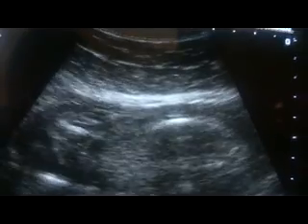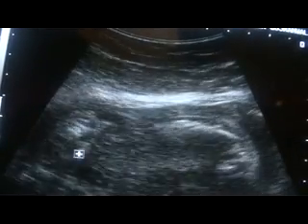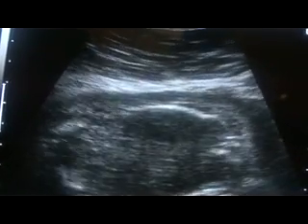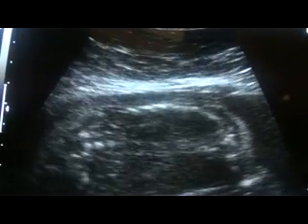Let's see what the gestational age is by this parameter — something around 22. Let me redo that. Somewhere I was wrong, let's have it again.